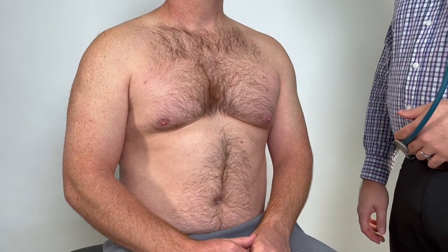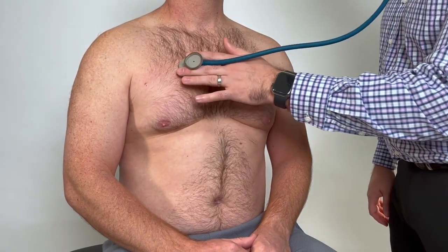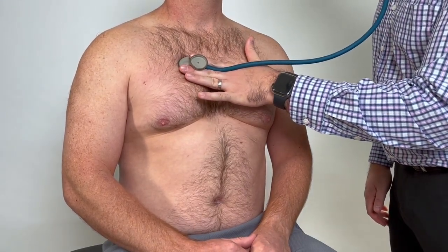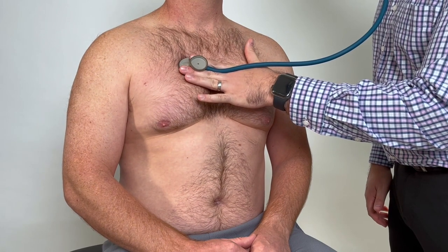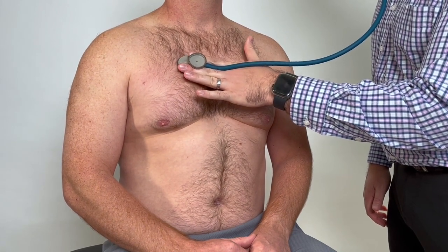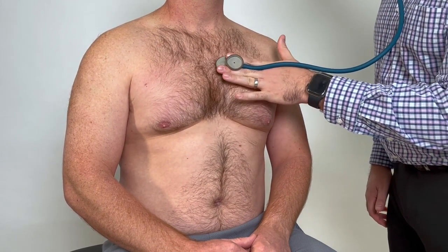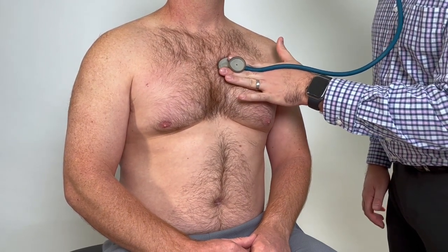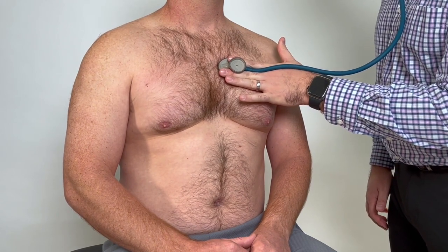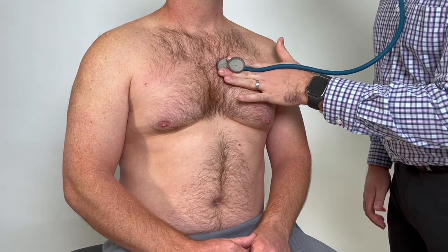To assess the four precordial regions, begin with the aortic region at the right second intercostal space, just lateral to the sternum. Next is the pulmonic region at the left second intercostal space, just lateral to the sternum.